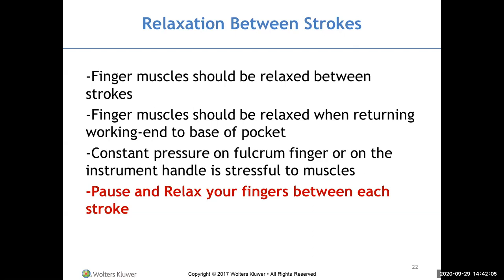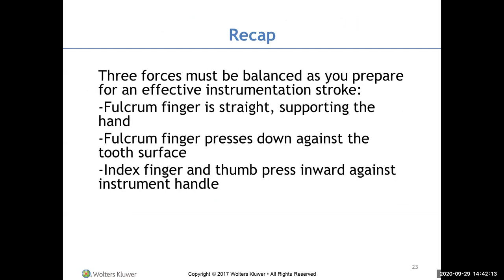Pause and relax your fingers between each stroke. The three forces that must be balanced for an effective instrumentation stroke are: the fulcrum finger straight and supporting the hand, the fingers not separated, the fulcrum finger pressing down against the tooth, and the index finger and thumb pressing inward against the handle to increase pressure against the tooth surface.